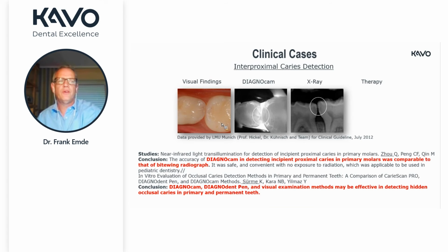I would like to add one thing to this. When you just have the change of the tooth, when the permanent tooth is beginning to resorb the roots of the primary tooth, there might be a time where the exact diagnostics might be more difficult, as the light isn't transported that well through the primary tooth. As I explained, we place the light sources between the roots, not outside the roots, and use it as a light pipe. Then the light pipe doesn't work as well as with a permanent tooth, so there might be a time where you have to be patient about that.